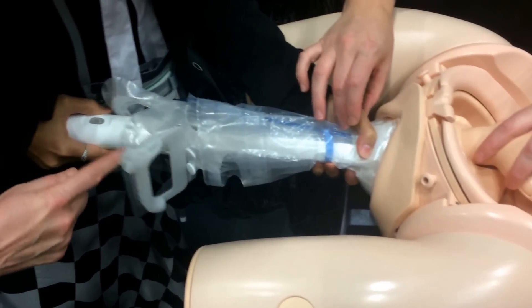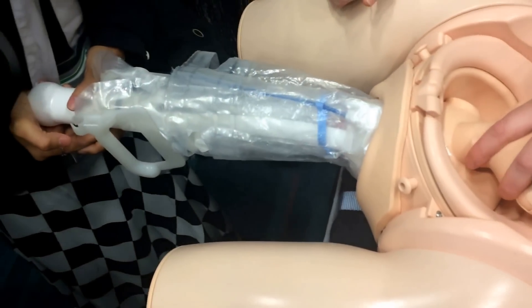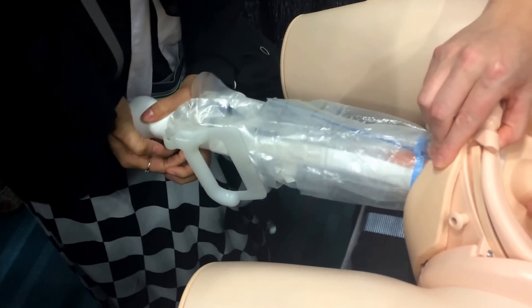Now take this hand away and just push. Sort of push in — push pretty hard. Keep pushing, more and more.